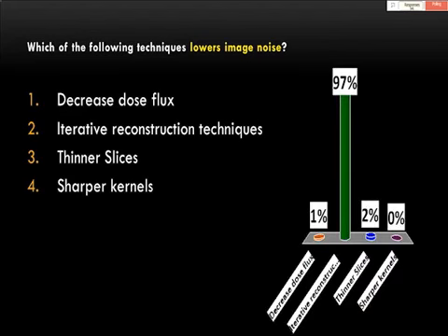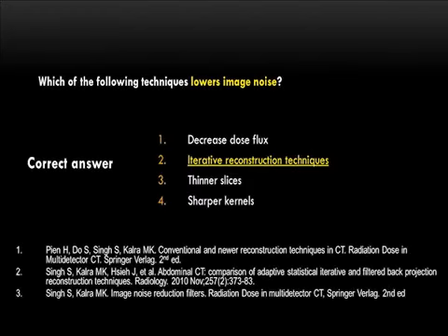All right, perfect. I think almost everyone got the answer right. Moving on to the next slide. This is the right answer. IR does lower image noise.